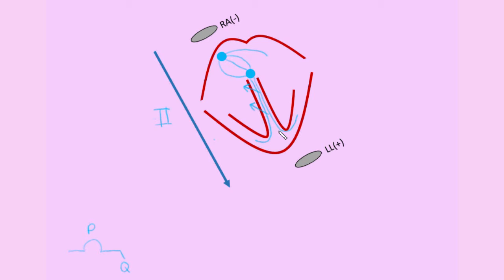After the Q wave, you start to get depolarization of the ventricles. In a normal heart, the left ventricle is much more massive than the right. So most of the depolarization is going to be related to the left ventricle. So we have depolarization that proceeds from the inside out of the ventricle. And again, since the left one's greater, we're focusing on that one. And all of this depolarization is moving towards our electrode, giving us the positive R wave in lead 2.